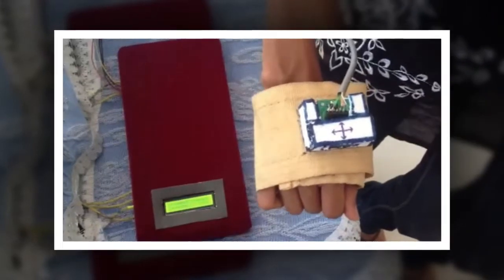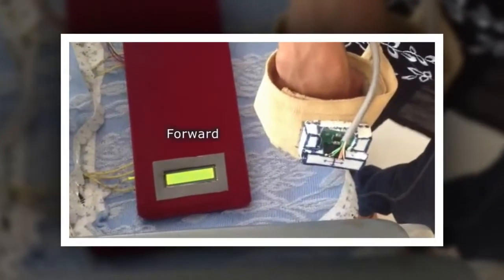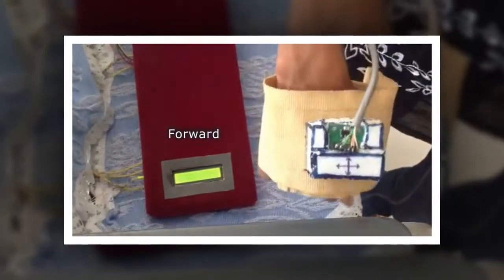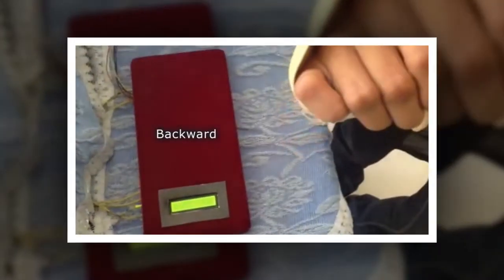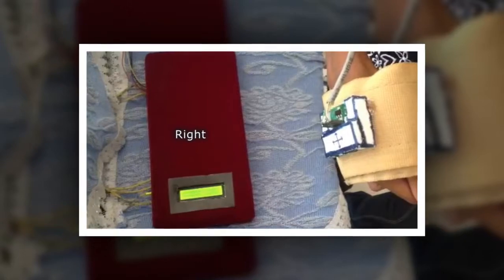If it is moved in the forward direction, this will be displayed on the LCD screen as forward. Now I turn the accelerometer in the backward direction — this is displayed on the LCD screen. The same thing applies for the right condition and the left motion.